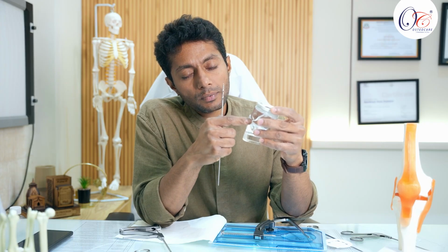So the fixation is much superior than fixing it far away from the actual root tear, like we do in the traditional transtibial technique. Number 3, the suture materials are not in the bone, and so we can use this particular repair technique when we do concomitant ACL reconstruction or high tibial osteotomies, where we put screws in this part of the bone. So when the suture materials are present in this part of the bone, the implants can definitely damage this tunnel and it can cause tunnel coalescence. So these three are the main advantages of this particular root anchor.